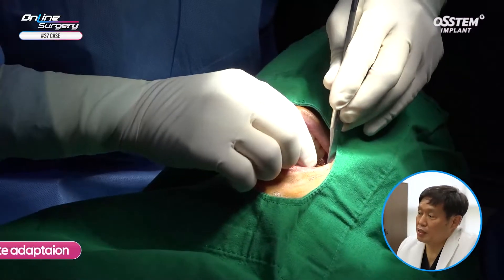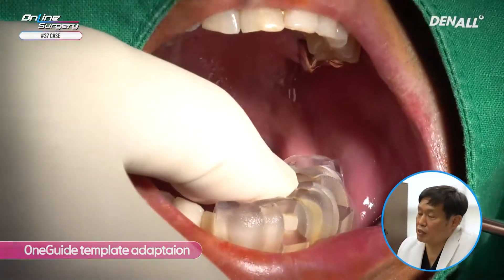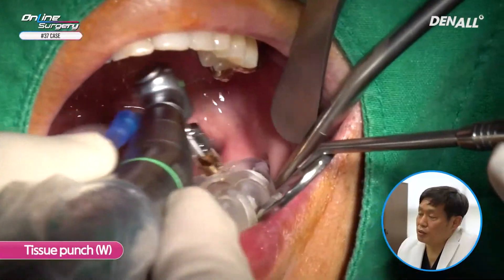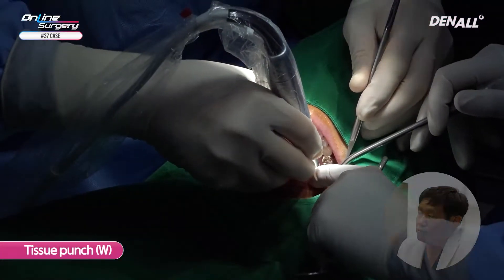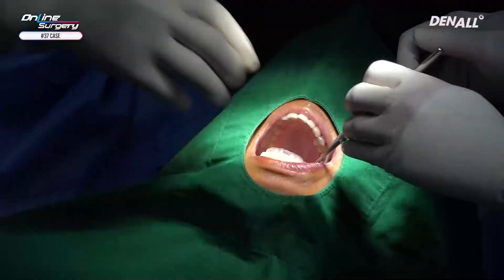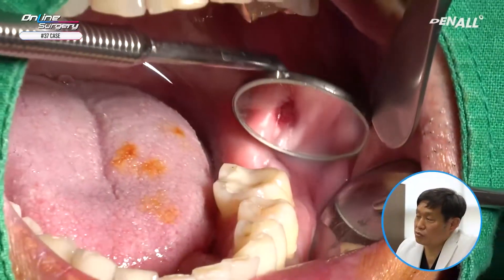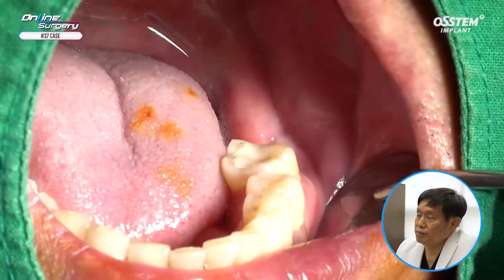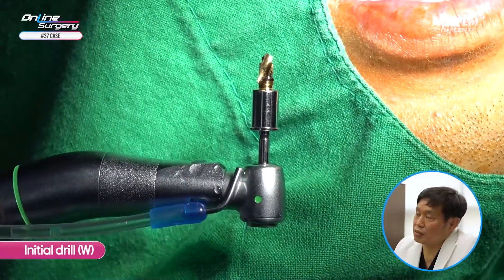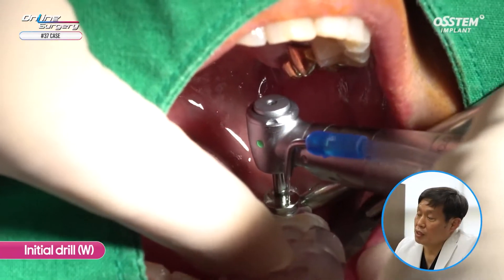This is the surgical video of the other side — number 37. The same one guide template is adapted to check whether the guide fits properly. A tissue punch is used to remove the gingiva. The one guide template is removed to check if the soft tissue is thoroughly removed, then repositioned. Initial drilling will be done, and in order to minimize heat degeneration, a pumping action is used.